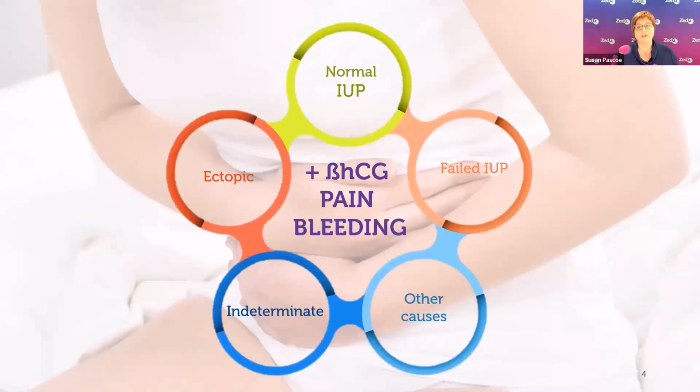And ultrasound is really useful to aid in the differential diagnosis. So at this point, unless there's a life-threatening situation that dictates immediate management, a key question you need to ask yourself is: is there a chance of a viable pregnancy? Now, this question is central to how the patient is managed. Are we dealing with an intrauterine pregnancy of uncertain viability or a pregnancy of an unknown location?